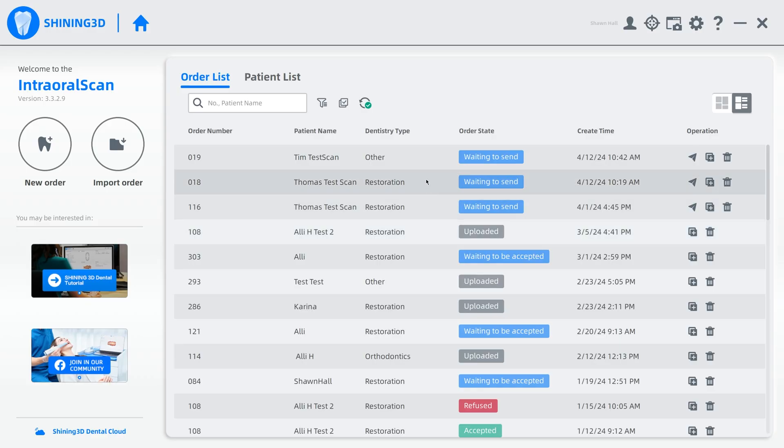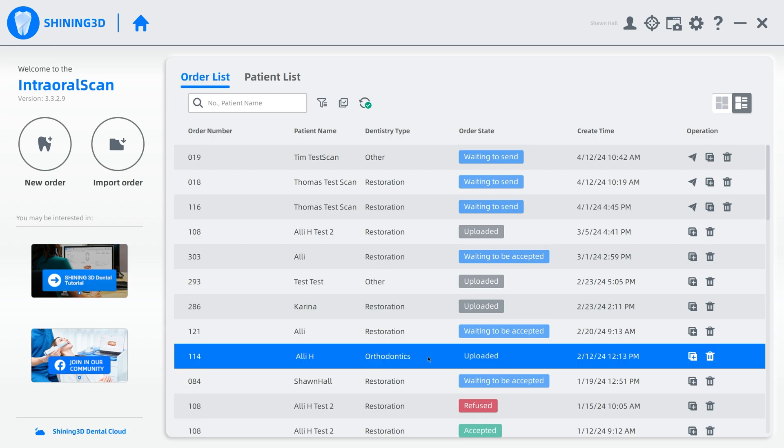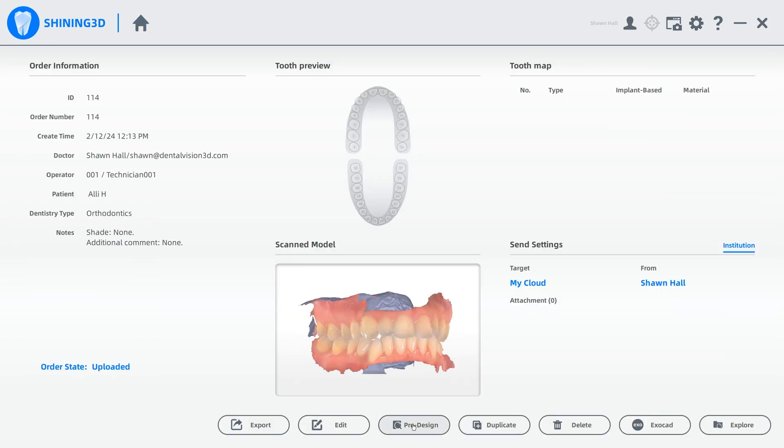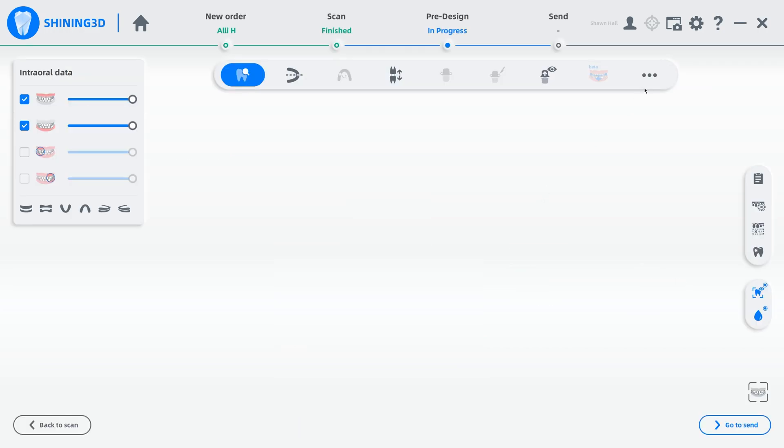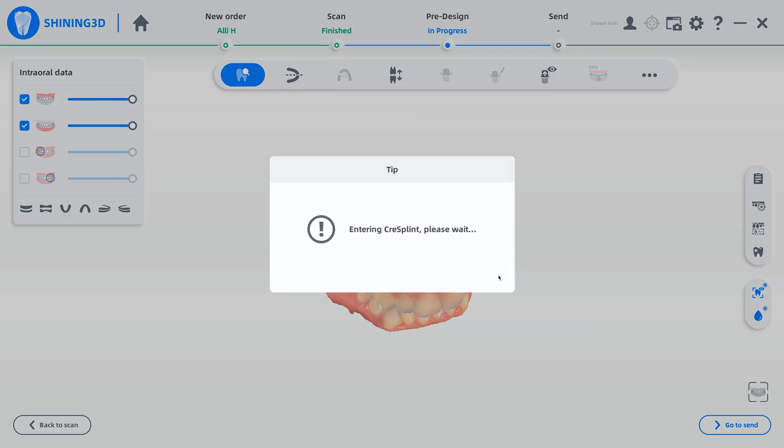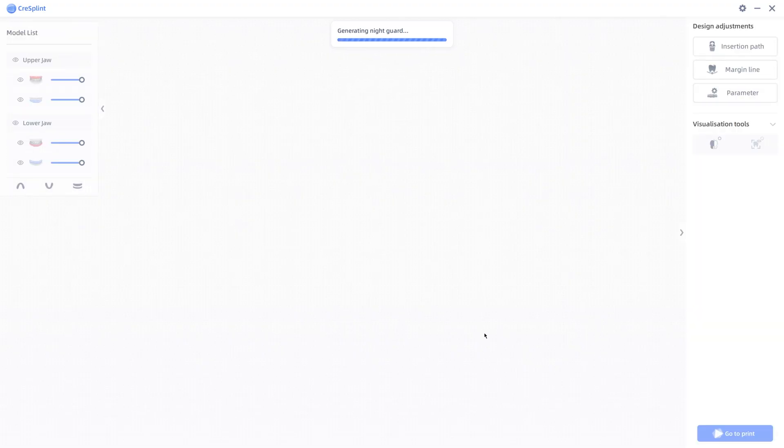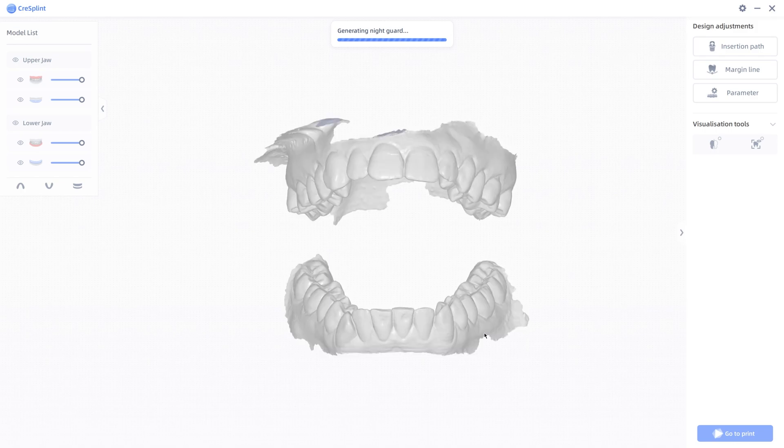So let's do this. I need an ortho case, and then we go to pre-design. I'm going to click my three dots here, and I'm going to choose Cree splint. I'm going to choose a night guard or a retainer, it's up to you. I'm going to do a night guard, we're going to put it on the maxilla. Okay. All right, so now it's going to load in the models so that it can build the virtual bite splint onto them. It might take a few seconds.